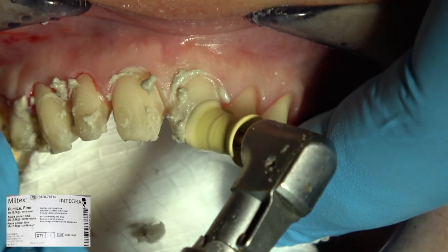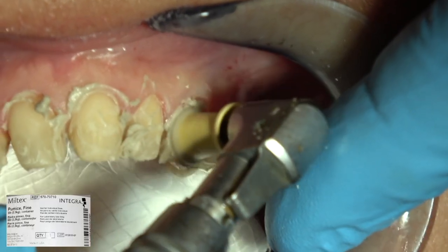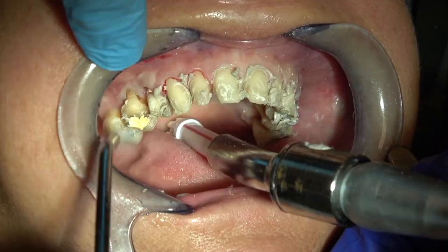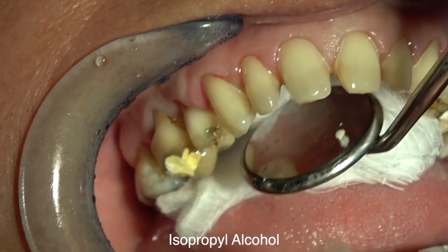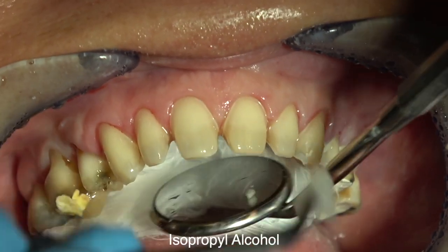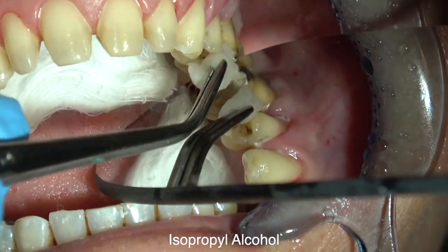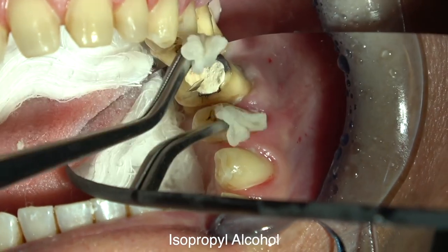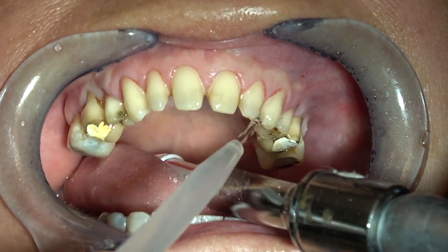Don't use peroxide if you're going to be using composite cements because it can affect composite. Don't worry if you have a little bleeding - I'm going to rinse all that off. Then I'm going to wipe the teeth with isopropyl alcohol on a cotton ball. This gets to places that the pumice on the rubber wheel couldn't get to, giving them a good scrub to get any little bits of cement, adhesive, or plaque off the teeth. Then rinse again.